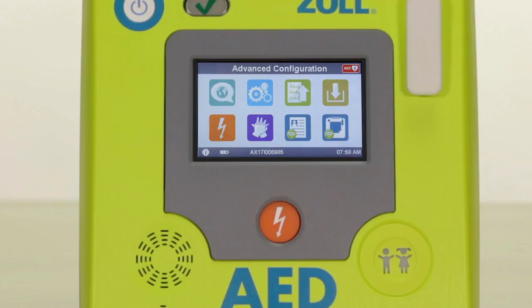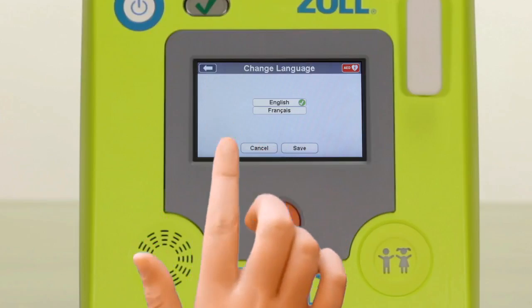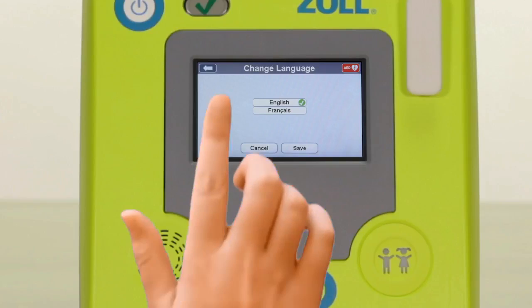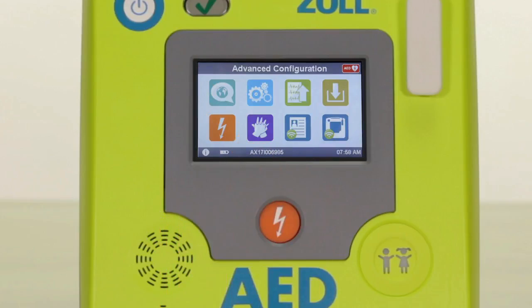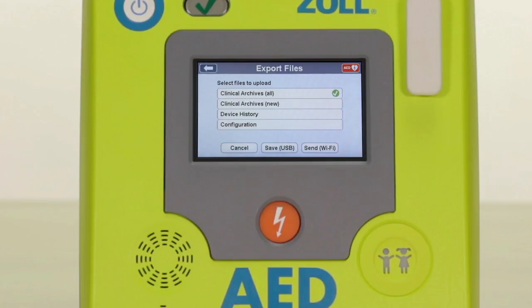In advanced configurations there are eight icons. The language icon and green arrow export icon have identical functionality to the icons you saw in the previous basic configuration screen. The language icon allows you to change the language of voice and text prompts on your AED — note that language options differ by region and you may have only one option. The export icon allows you to export configuration files to a USB drive.